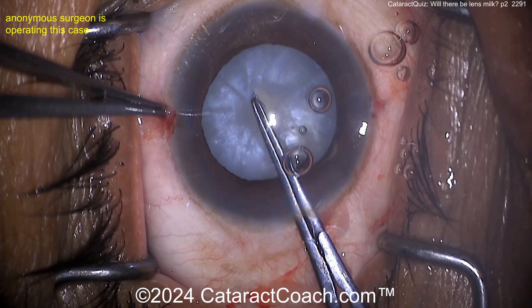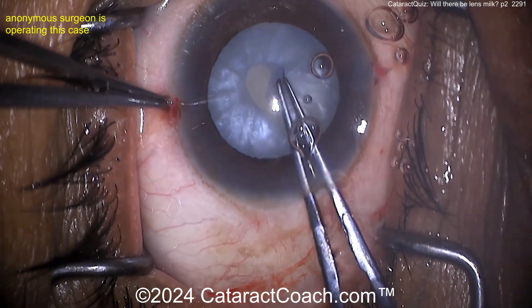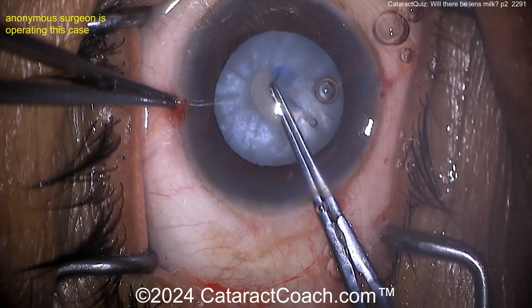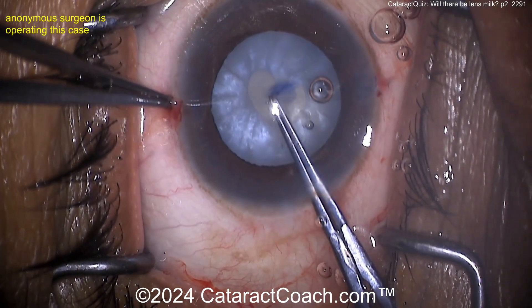Grabbing with the forceps — let's move quickly here, get this done before this runs out on you. Baby rhexis, let's do a double rhexis technique — great idea. Rotate that around, depress it a little bit, express out all that liquefied lens cortex.